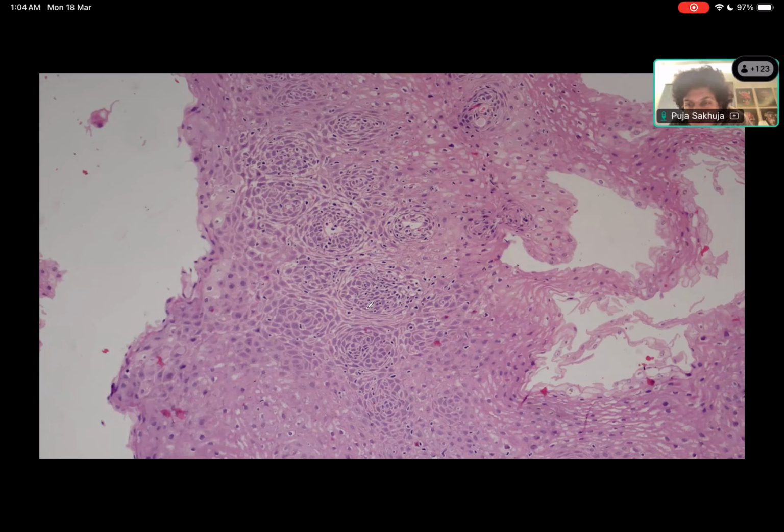When you start seeing mitosis also in the upper half of the squamous epithelium, these are changes associated with reflux. In addition, if you see neutrophils infiltrating the epithelium, then it is reflux esophagitis, because the itis component has also come. Some people will just have changes of reflux without much inflammation. Then it is just changes of reflux that are seen.